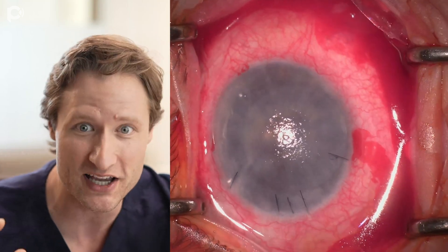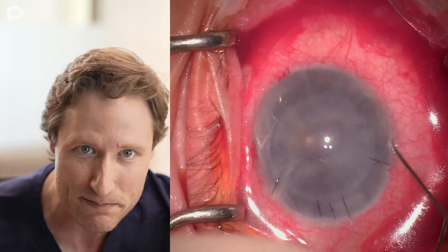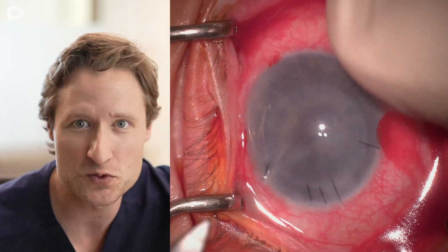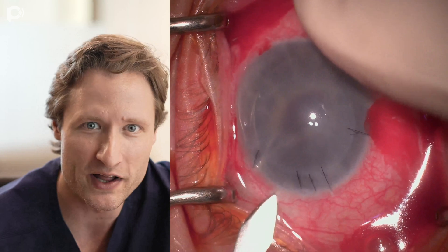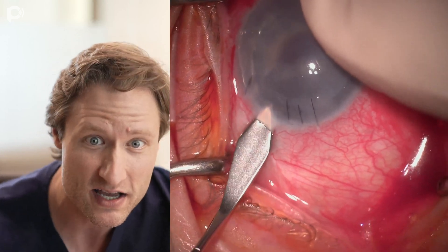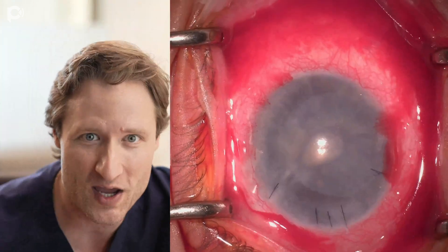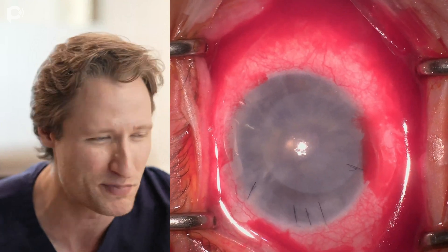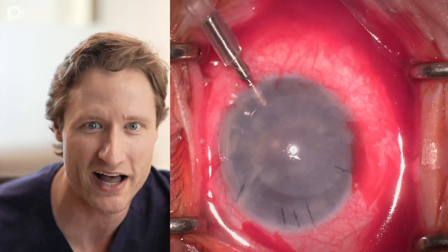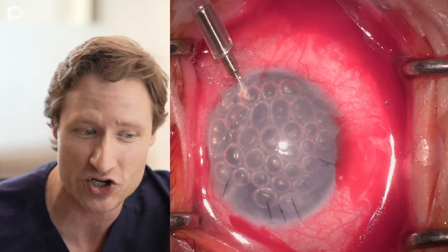So the patient is sent to us with the idea of trying to replace this detached DSEC graft with a DMEC. This is the complete, full, unedited recording of the operation, and I want to walk you through the steps and the special considerations. We're doing the surgery under topical anesthesia in our office, supplemented with 1 cc of sub-Tenon's liposomal bupivacaine. We emphasize the 1 cc component because we don't want to deliver a large volume of fluid behind the eye that pressurizes the globe and contributes to anterior chamber instability.